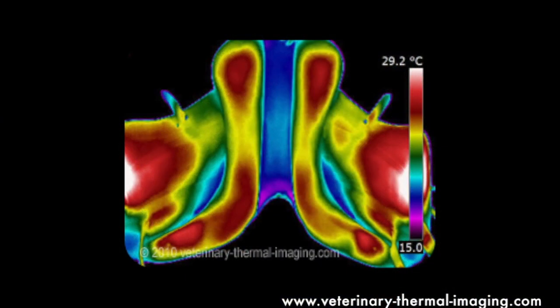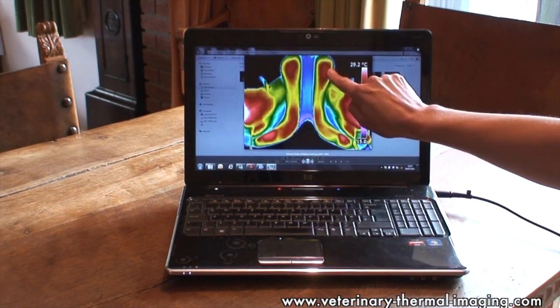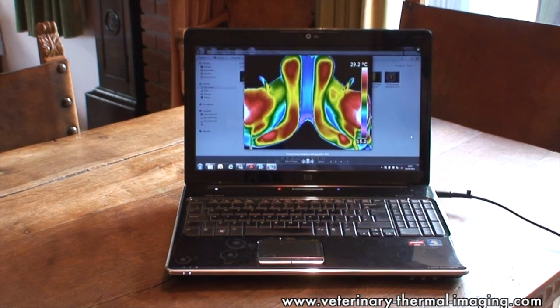Thermal imaging of the underside of the saddle after the horse has been ridden can give you a really good objective view of how well it's fitting or not. In this instance, this saddle is bridging and it's only in contact with the horse's back at the front points rather than evenly throughout the panels, so this isn't a very good fit for this particular mare.